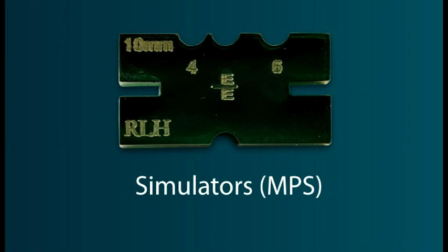this can be positioned in an end to end if the middle slot is used on the top. And if it is moved to the 4 millimeter facing the patient, it will be 4 and 10. If it's the 6 millimeter, it will be 6 and 10. There is a third column that has end to end as well. However, rather than 4 and 6 options, it has a 5 and a 7 millimeter option.